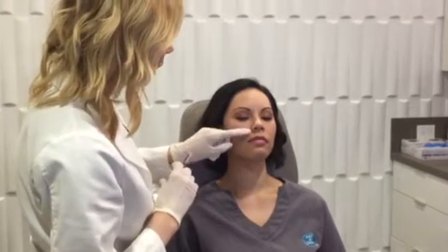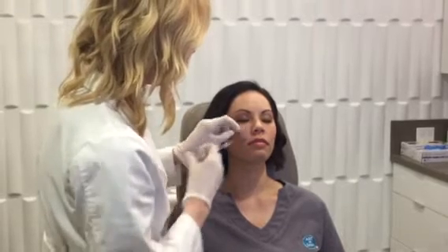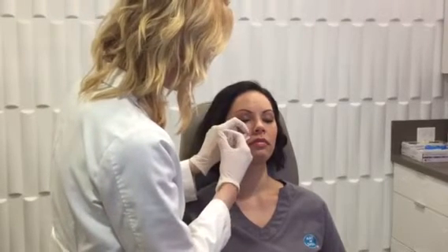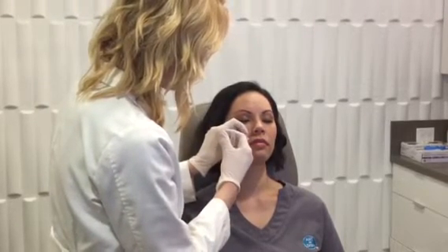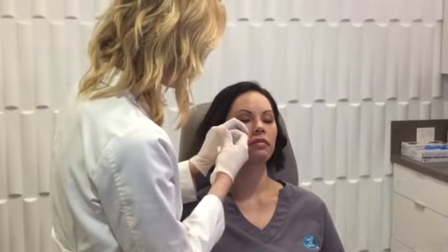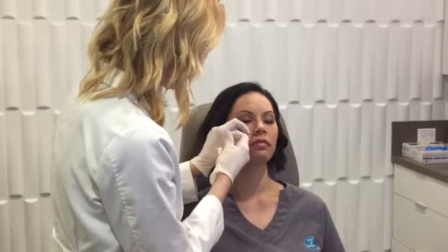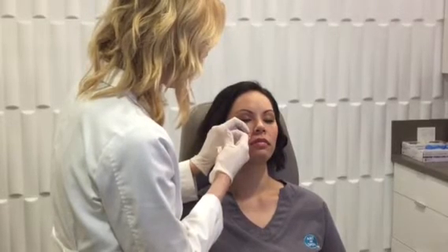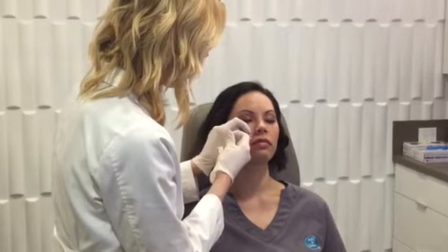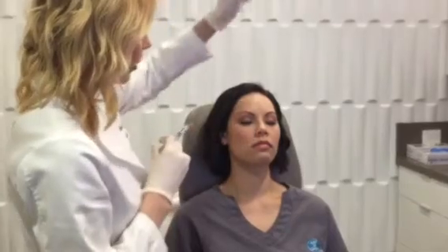I'm going to add a little bit in what we call the piriform fossa, which is the top of the nasolabial fold. We lose bone in this area, so a little mean poke here, 1, 2, 3. And I do reflux here because there's an important little vessel called your angular vessel, your artery or vein, which can be around here. And again, I'm depositing just a small amount, actually right on top of bone. And this helps lift the nose, because believe it or not, as we lose bony support here, our nose falls into our face.